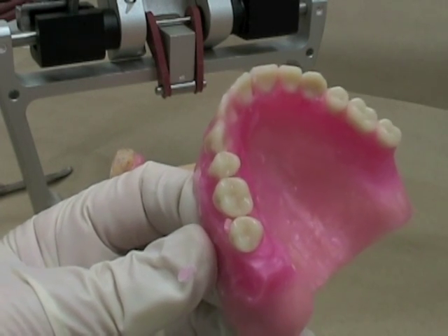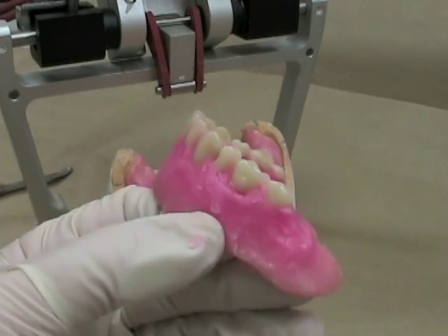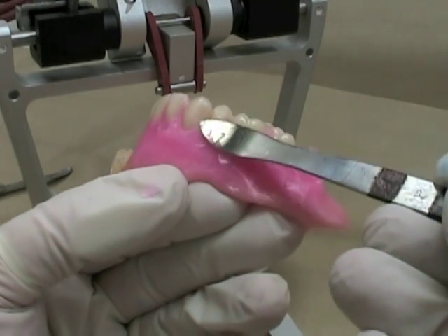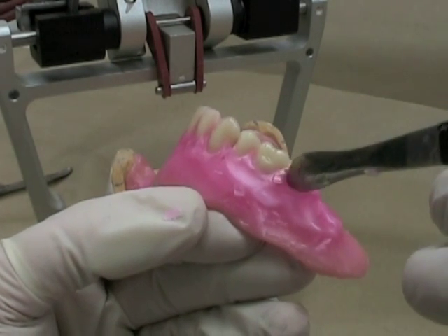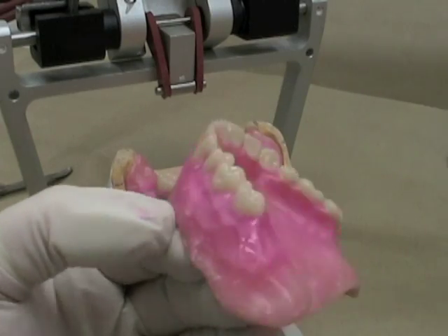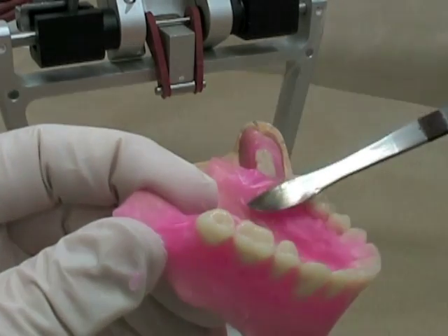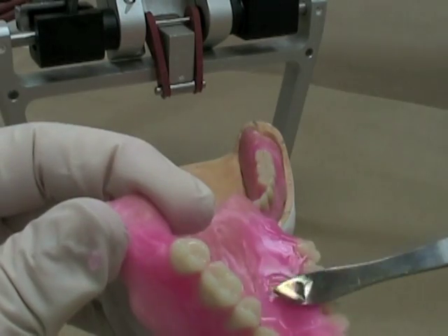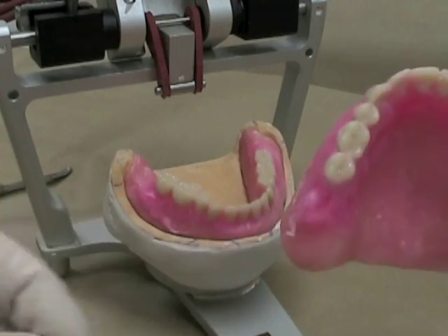I've got the teeth basically where I want them. I'm just going to remove a little bit of excess wax — again using a finger rest while I'm doing that. Then I can use any one of my spatulas to smooth and fill in the wax, same on the palatal surface. Make sure that your spatulas are good and warm so you can really get that wax nice and molten and smooth it. You don't want rough areas, sharp areas, or bulky drips around the teeth.